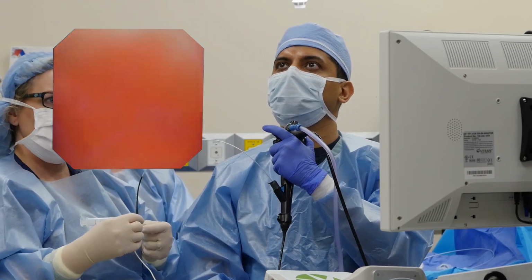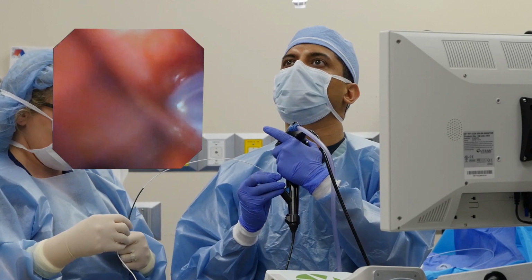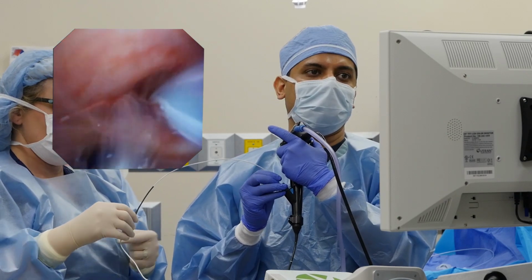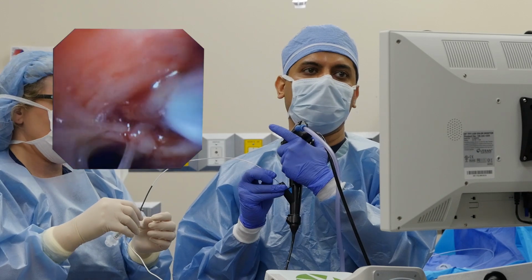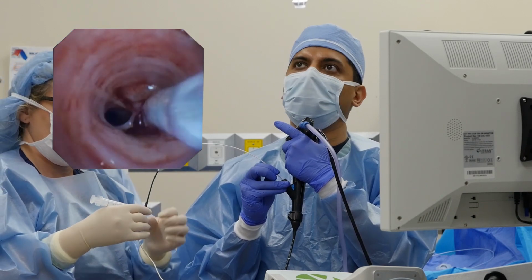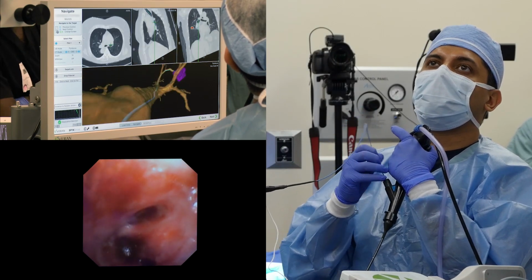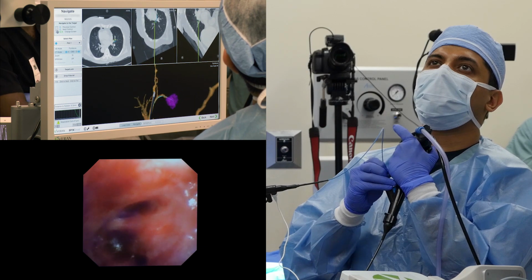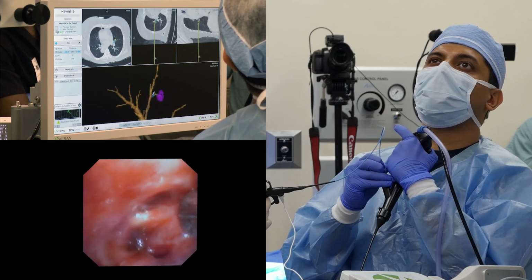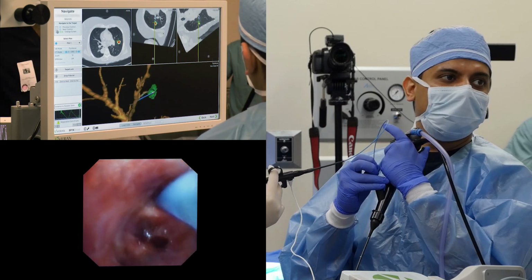You're engaging that first airway. I was on a 12 o'clock. We kind of come in one way. Yes. No, that's not the one? It's coming in a little anterior. Oh, okay. I know what it is. Yes. Right in it. Right in it.